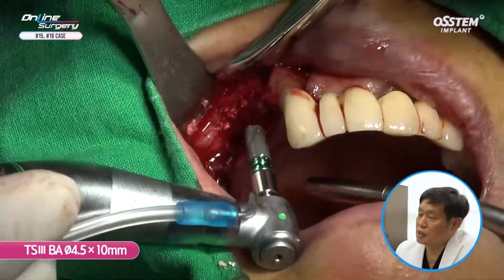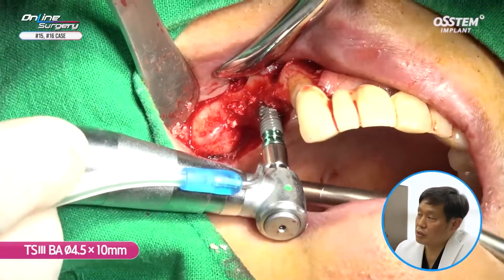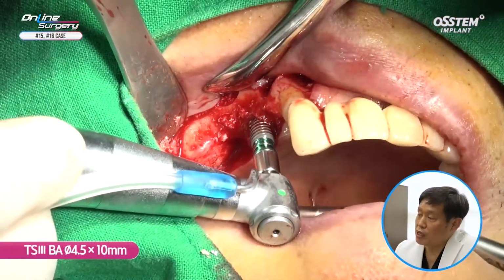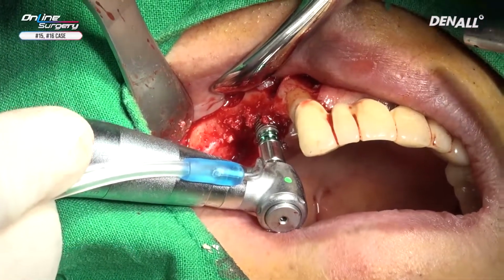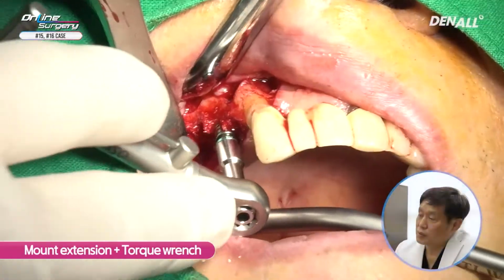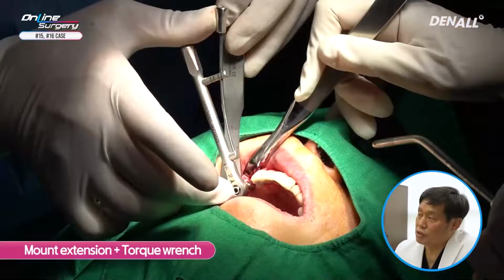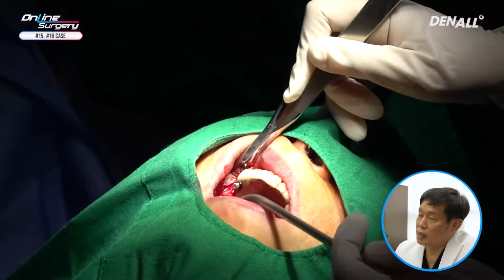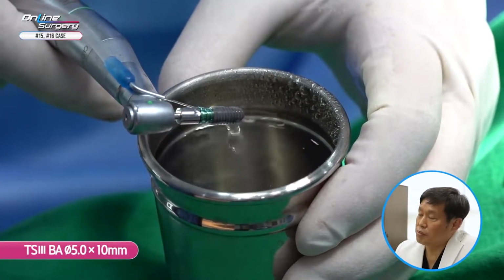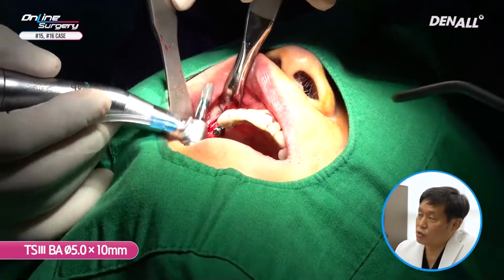A TS3BA surface, 4.5 by 10 millimeter implant is placed. Irrigate the implant sufficiently with saline water before doing the placement. Mount extension and torque wrench is used to find the final position. Primary stability is sufficient. A TS3BA surface 5.0 by 10 millimeter implant is placed on the distal side.